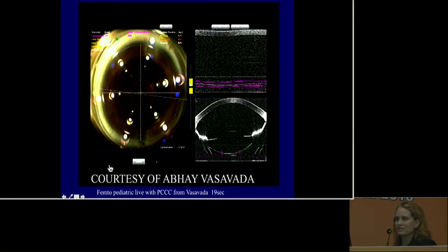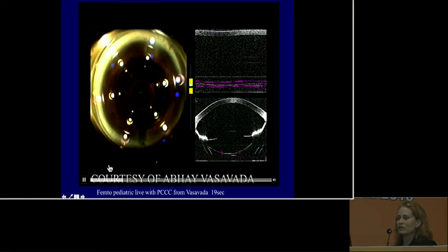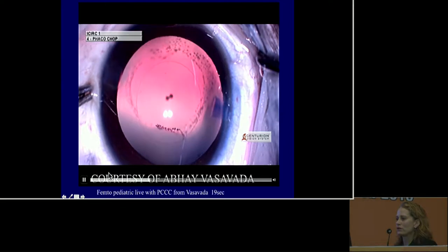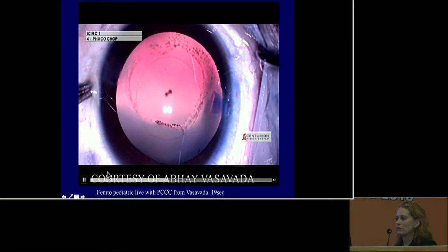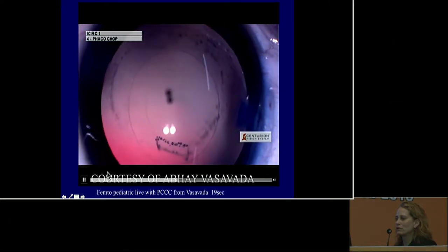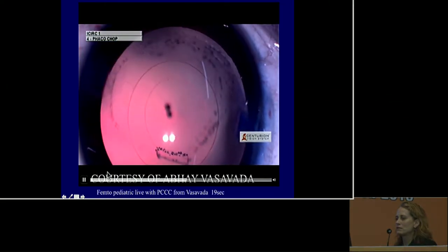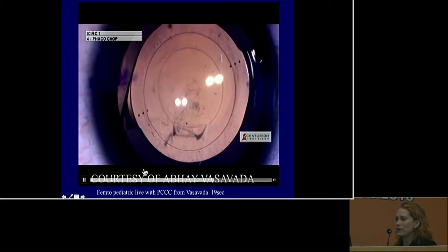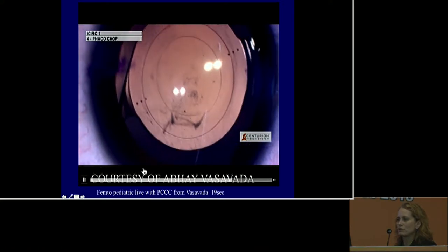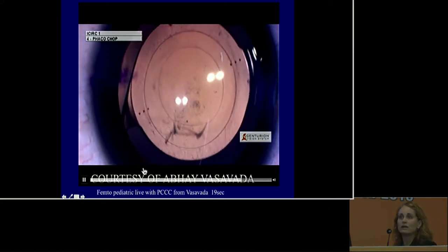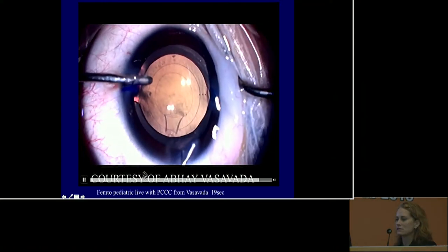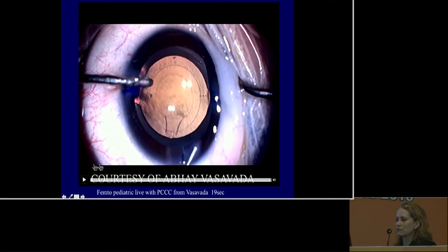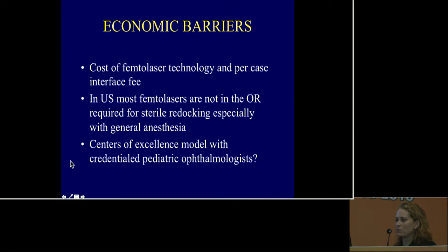With Dr. Vasavada's LensX experience, doing a primary posterior capsulotomy similarly results in contraction of the posterior capsule, which moves out of the visual axis. It is really fascinating that it can happen that way.